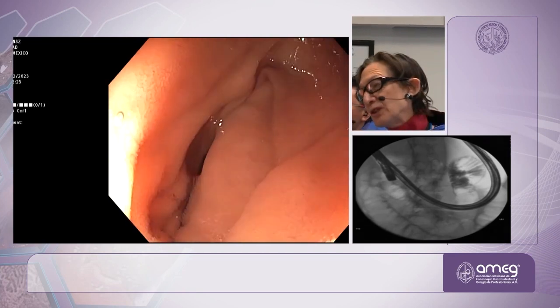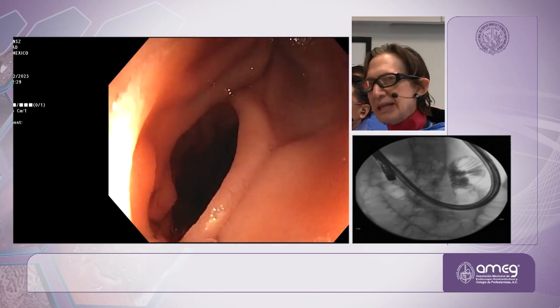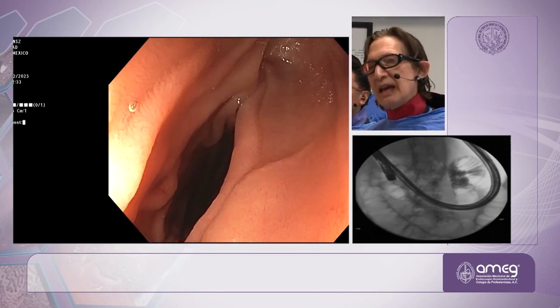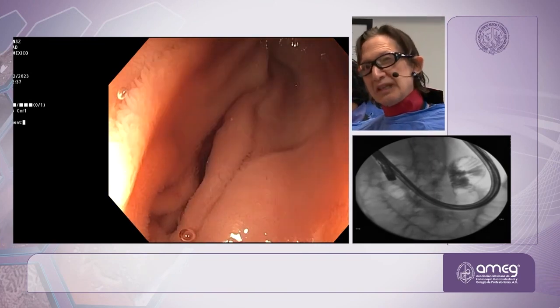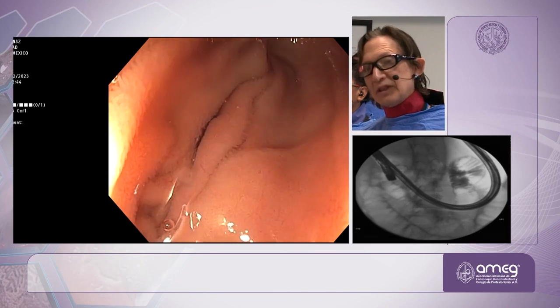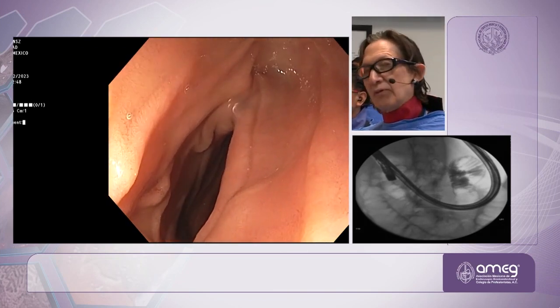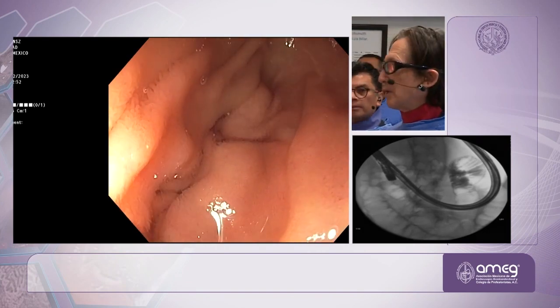So you can actually already assume if you put a duodenal stent, it's probably not going to help the patient that much. I think the issue for this patient may have way more to do with also the gastroparesis that these patients develop. So I think doing a gastroenterostomy is reasonable. You know, she has obviously some obstruction, it's contributing, but the hope is that we can give her a better quality of life by creating an EUS-guided gastroenterostomy.